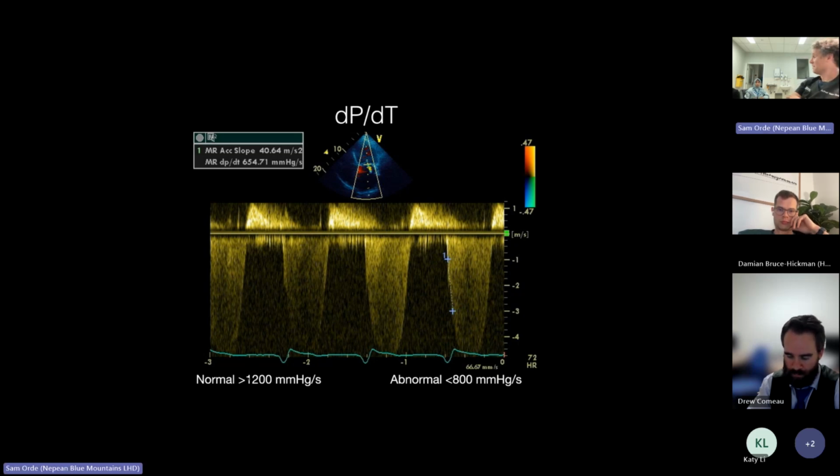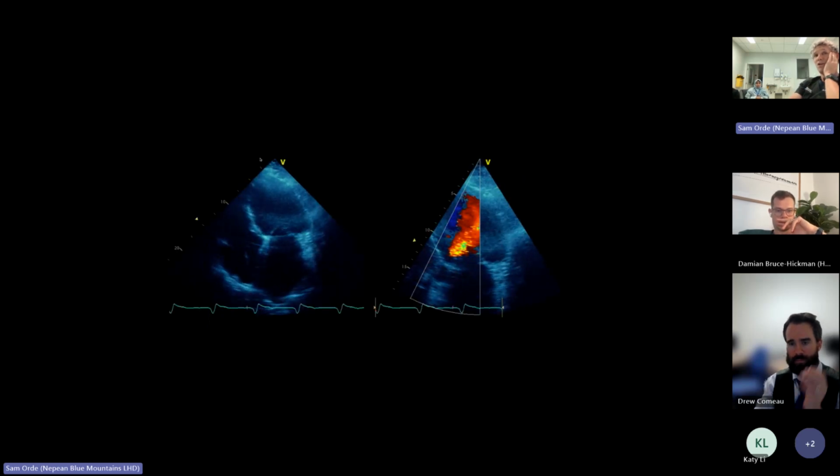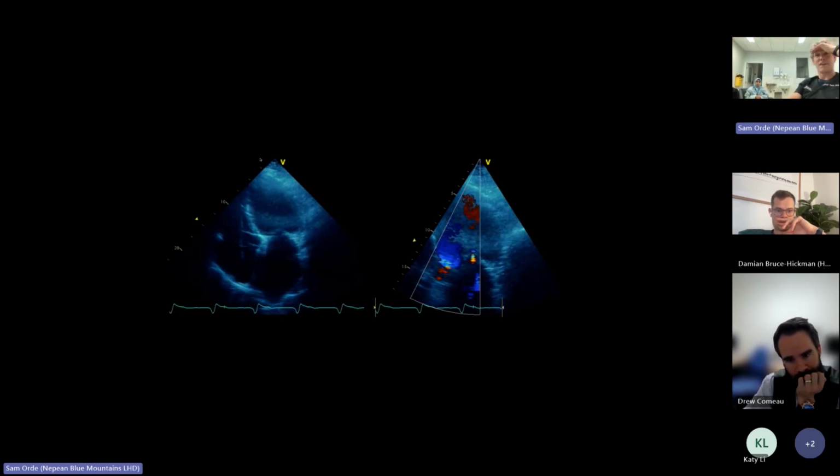Okay, Umi, I would like you to try and tell me what's wrong with this trace. So first of all, I've measured it off this patient here. What do you think of their ejection fraction, first of all? What do you think of this heart? It's severely reduced. Excellent. Severely reduced ejection fraction. Is it chronic or is it acute? It looks chronic.